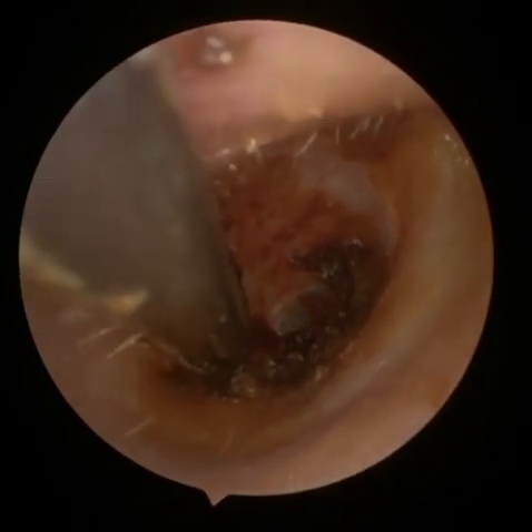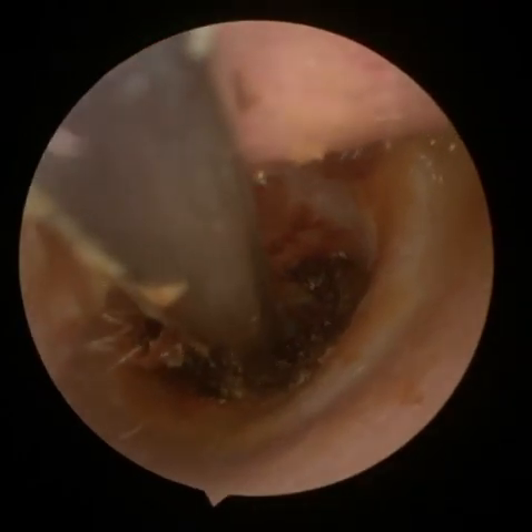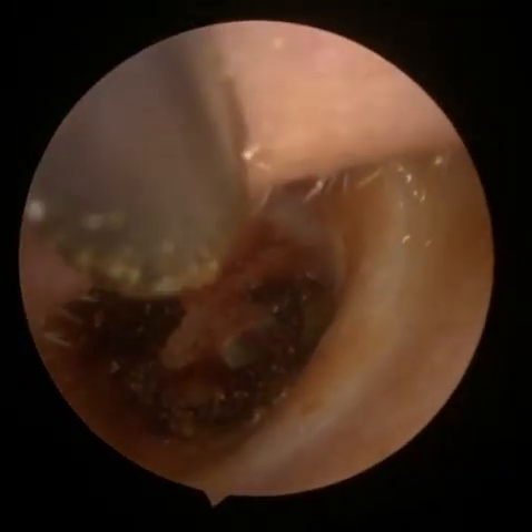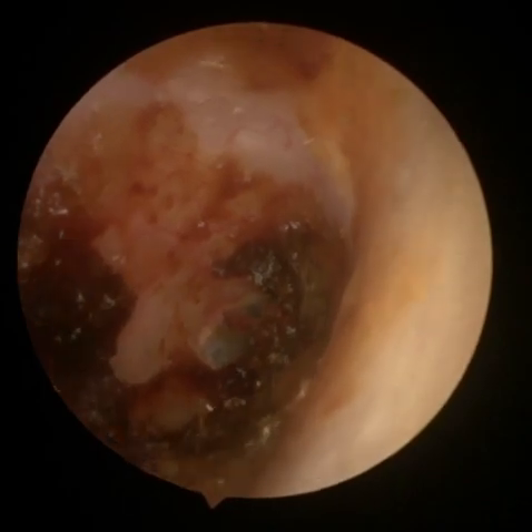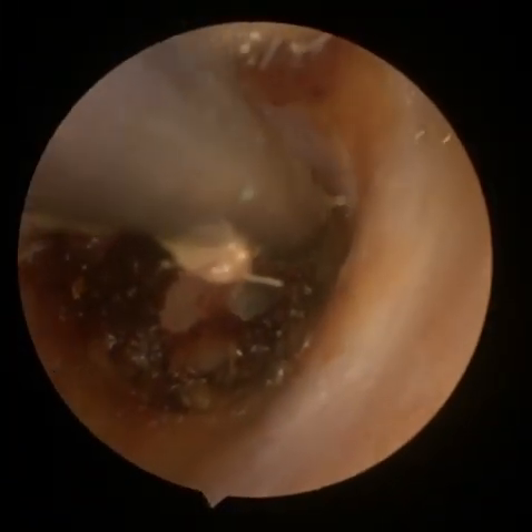Naturally with a pair of three-and-a-half mag loops it's always going to be difficult to remove something like this. Usually I wouldn't do this without a video endoscope or at least a set of loops which are at least five mag. Here we go — there's a little bit of a twitch there from the patient.